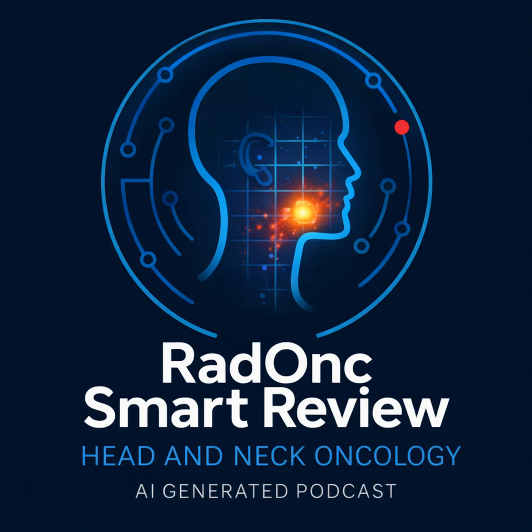That's the whole game. This was an extensive and critical deep dive into the practical application of OPC radiation planning. Let's quickly recap the 6 key learning points we hammered home today. First, the required simulation setup: supine, mask, neck extended, shoulders down, and the non-negotiable necessity of MRI fusion for mucosal staging. Second, that systematic 5+5 rule for target volume definition, emphasizing tight, anatomically confined margins backed by the DAHANCA data.